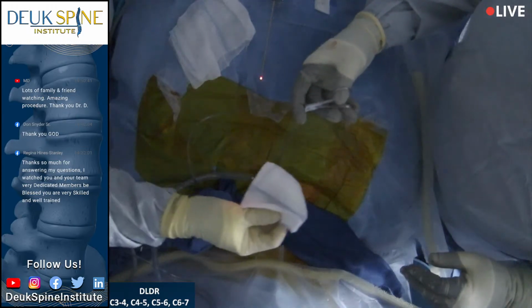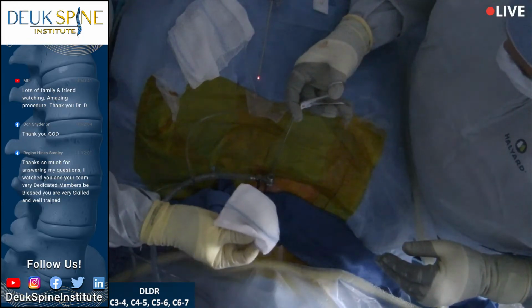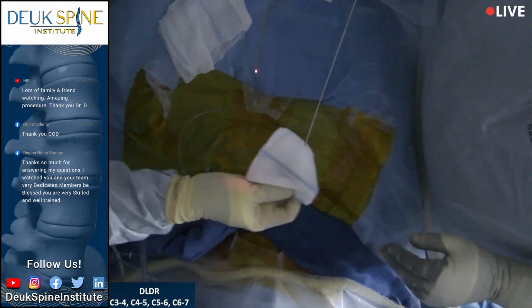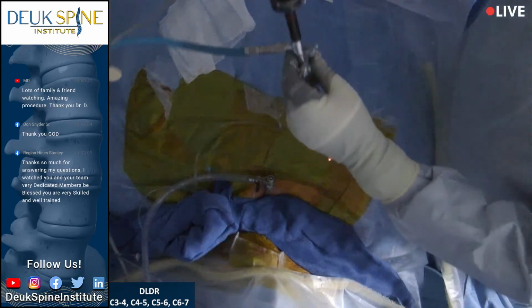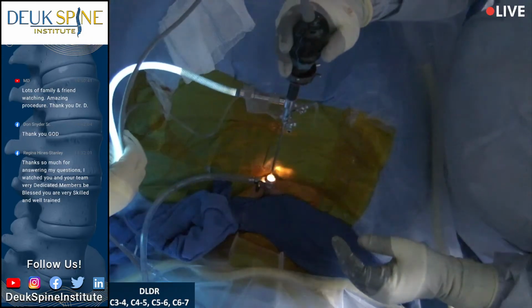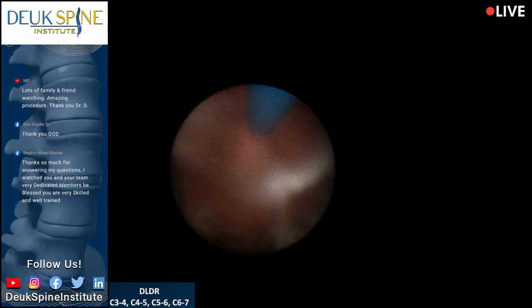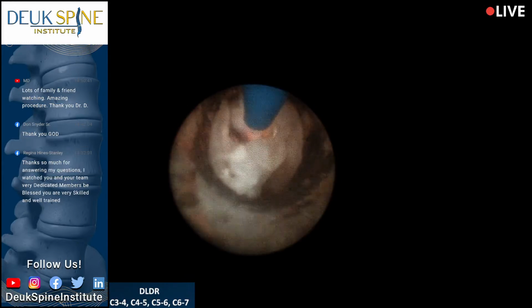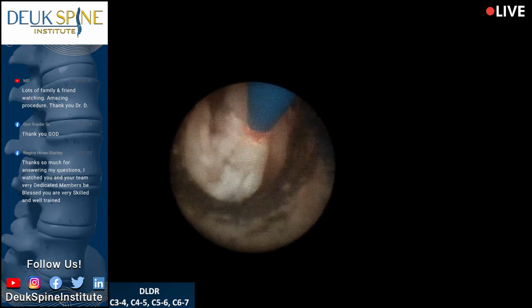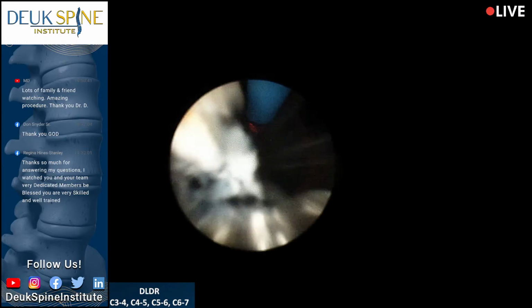Thank you, Jordan. Great job, by the way, great attention to detail. That's a big herniation back there. I think I got part of it. Go back in. Thank you. I told you it's big. Still some left. I'm going to bisect it. Cut it in half. Bam. There's one half. Out. There's the other half. Out.